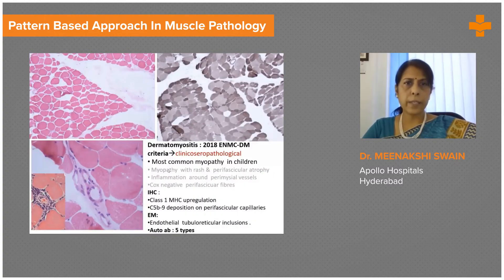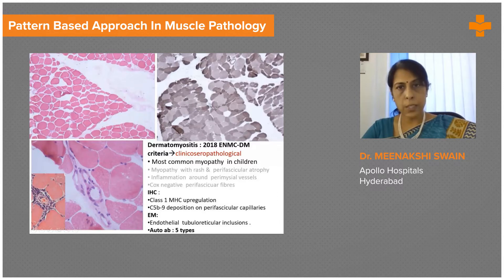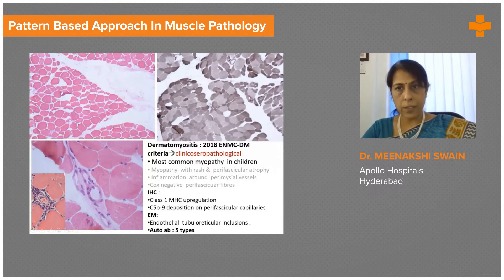Now this is the example of a young girl, a five-year-old, who has a typical skin rash and muscle weakness. She had a biopsy, but she had been previously treated with steroids. Looking at this muscle biopsy, this fascicle and yet another fascicle — the periphery of the fascicle has these small atrophic fibers. All these small atrophic fibers are essentially located at the periphery, highlighted by this enzyme stain. Perifascicular atrophy in a child with rash is usually indicative of dermatomyositis.